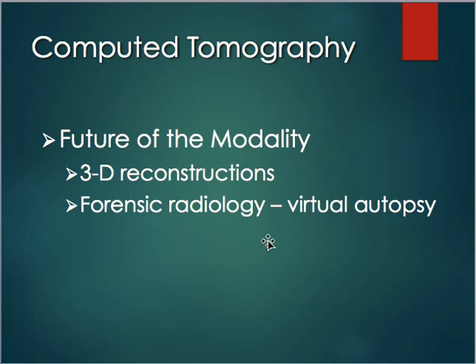Another thing that they're using it for is forensic radiology, so doing virtual autopsies on patients, so they don't ever have to cut the patient open. This would be great for patients, especially ones that it's against their belief to have an autopsy done where they cut the body open.